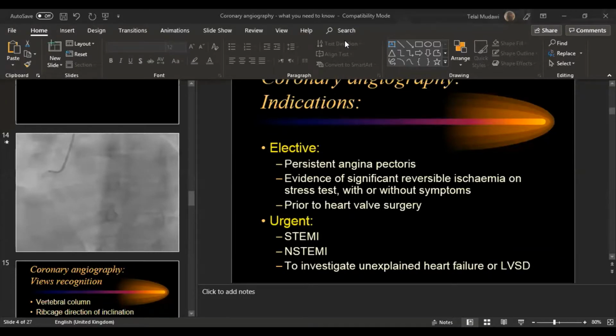في حالات ثانية اللي هي الكونفرجن، انت سالتني عن الكونفرجن تكونفرت كيف. فممكن تلقى انه في الزول ده عنده a lot of loops في السبكليفين حقته، السبكليفين ملولو جدا. فباي ذا تايم الكاثيتر حقك تتلولو في اللوبس حق السبكليفين لحد ما تخش الاسندنج اورتا، ما بكون عندك توركينج ابيليتي، فبتحاول تلفها ما بتقدر، فبتضطر تخش فيمورال عشان الدخول يكون سهل. مرات بيحصل لك راديال سبازم، والبيشنت يخش في بين، ما تقدر غير انك في النهاية تحول لفيمورال. لكن طبعا كل الحالات دي are not very common. يعني انا بقول لك الفيمورال بتاعي less than maybe 2% 3% at the most. اوكي.